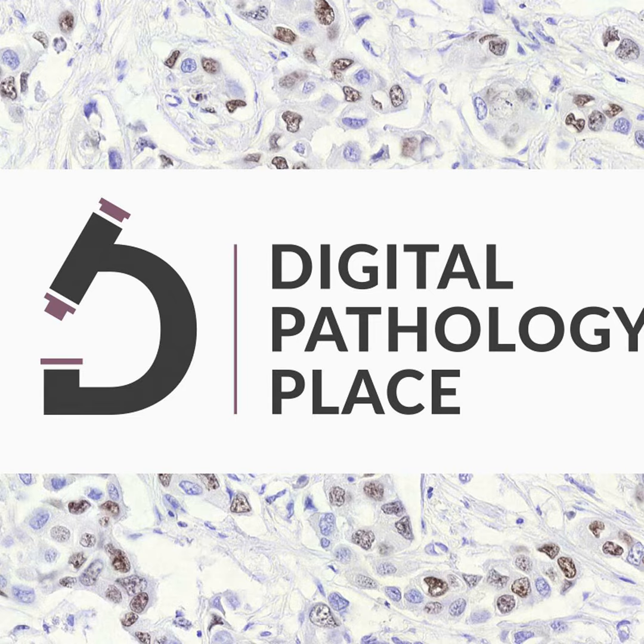And then the goal, of course, is using statistics to disprove the null hypothesis. The null hypothesis in this case would be that digital pathology is nowhere near as good as microscopy. To disprove that, the way we do it is take a difference in accuracies, and then that difference has to be a certain amount.